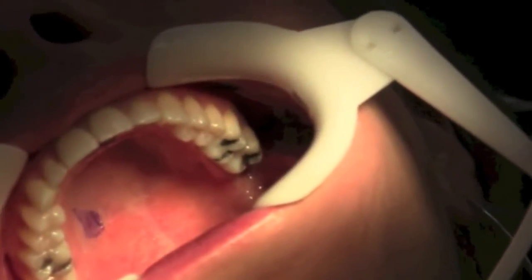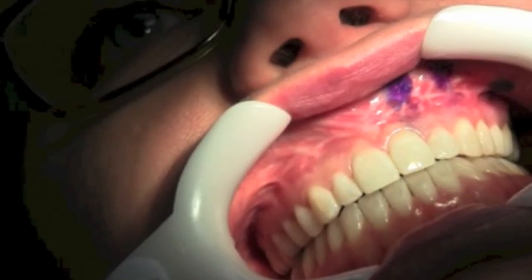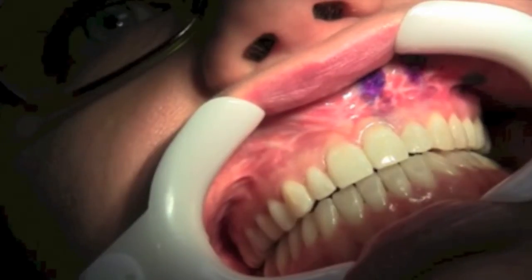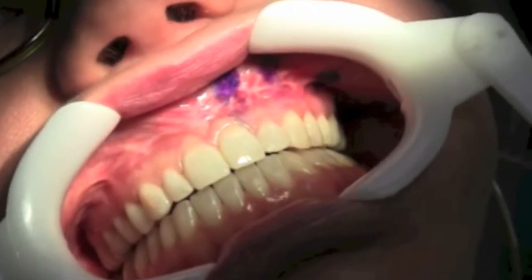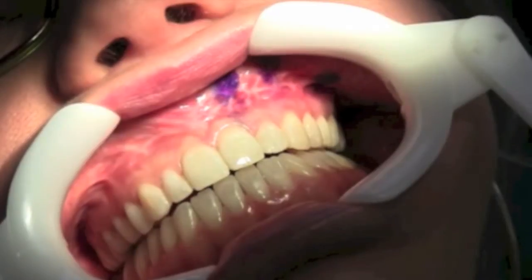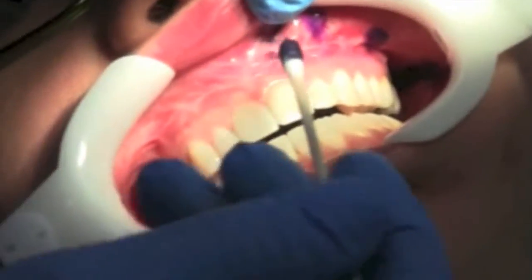Now we're going to talk about infiltrations of the maxillary. Infiltrations are done directly above each tooth on the maxillary that you will be working on. So for example, if you were working on the 2-1, the 2-2, or the 2-3, it would be an infiltration associated with the ASA.